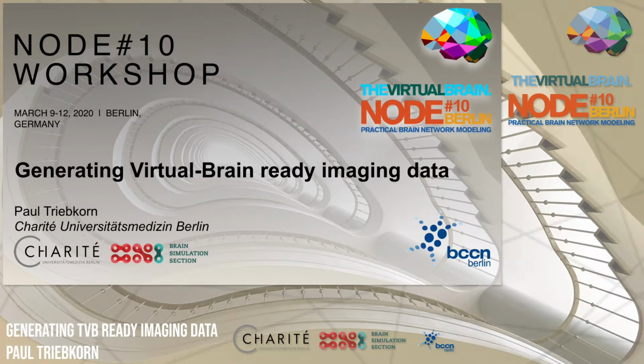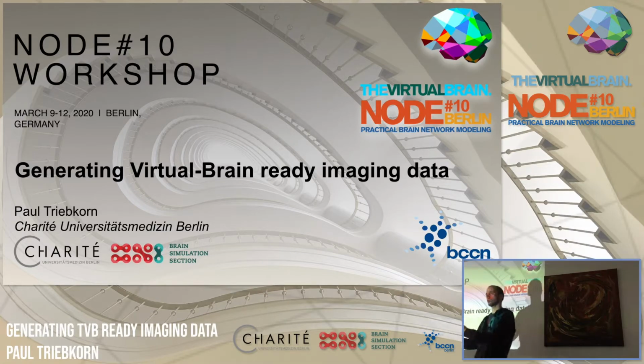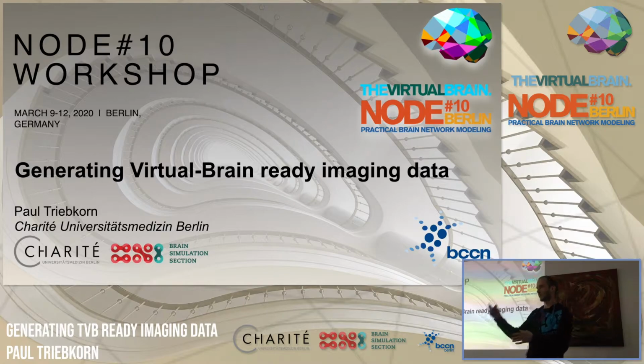Okay, good morning. So we'll talk now about how to generate the backbone for TVB. So far we heard a lot about theory, what TVB can be used for. You had some experience with the GUI and the Jupyter Notebook, but now we will focus on the whole work that has been done or has to be done before we can actually go to the step where we're simulating with TVB.